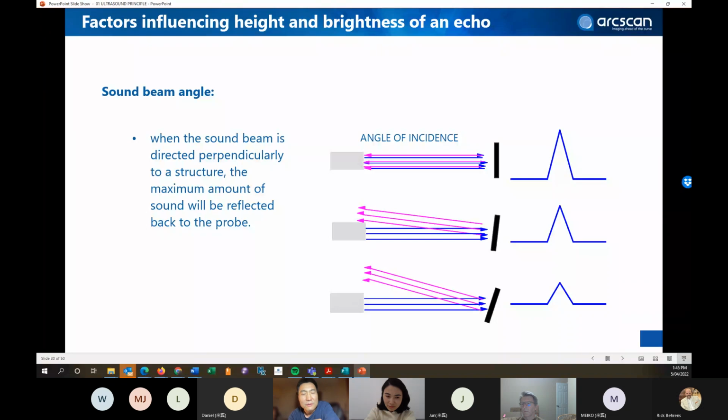So the NMPA will come back to us and say, okay, should you claim 50 or should you claim 35? From a marketing perspective, the higher frequency, the better. The doctors, clinicians believe that, right? But now we have to answer the question from NMPA. How can we explain to them, right? If we do the 50 megahertz test, we won't be able to pass the requirements. But if we don't do it, NMPA won't be convinced. So what should we do?